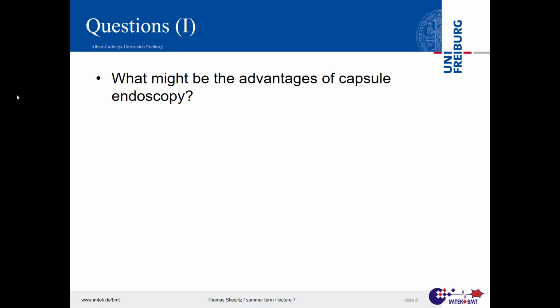So, already talked about that. So, advantages, it's small, it can travel through, you can get images there. The dream would be really to have something like a traveling submarine that can navigate by itself, that can go up and down if you want to do something, and probably that has a kind of Bob the Builder toolbox with a submarine where you can do different things.